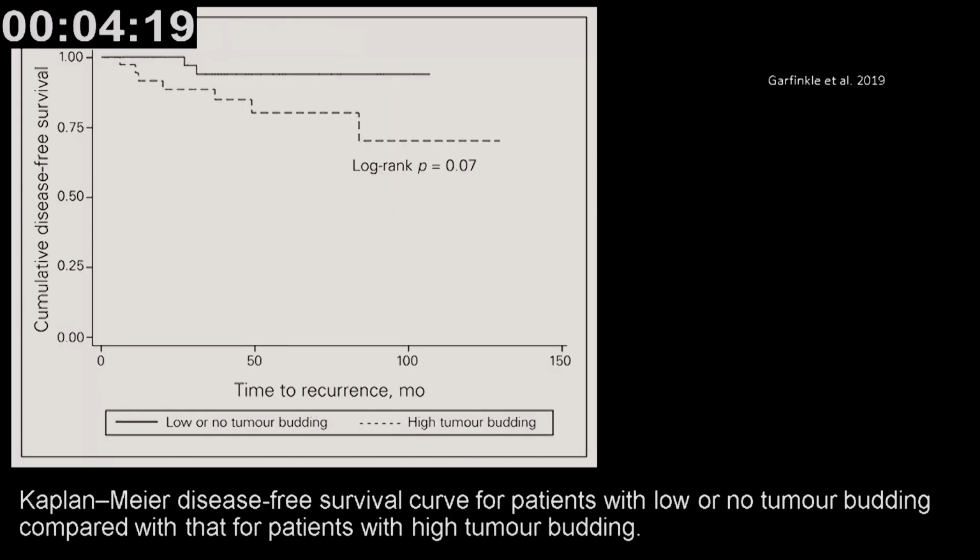And what is the importance of tumor budding? Here you see the upper, compact line is negative tumor budding, and the lower one is presence of tumor budding. So definitely disease-free survival is lower in the presence of tumor budding.